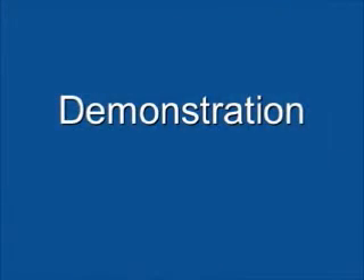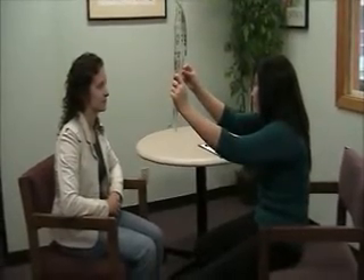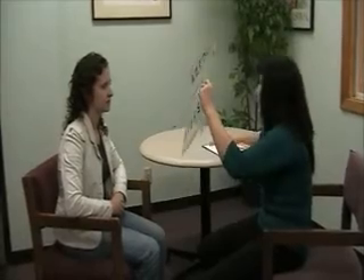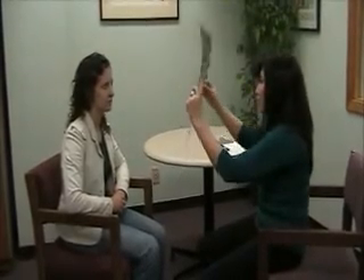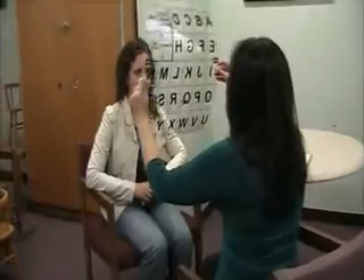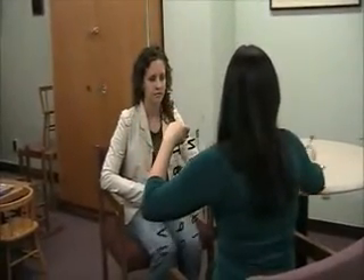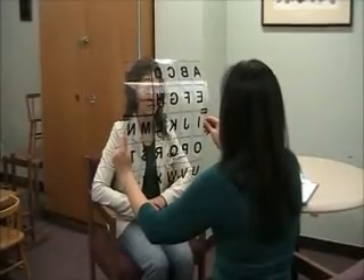Now let's watch this pair use the eye link board to spell out the words "on fire." O... N... space — "on"... then up... right... I... R... E... space... "fire"... "on fire."